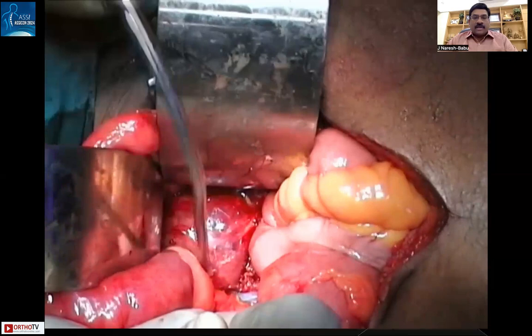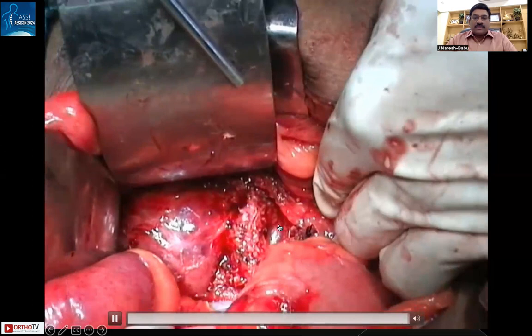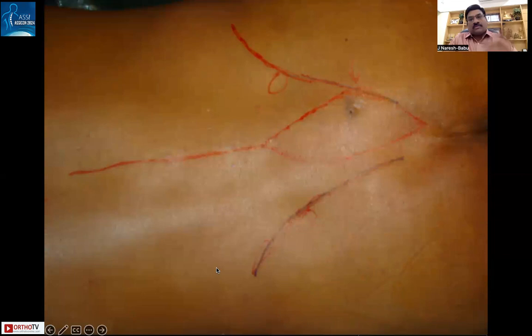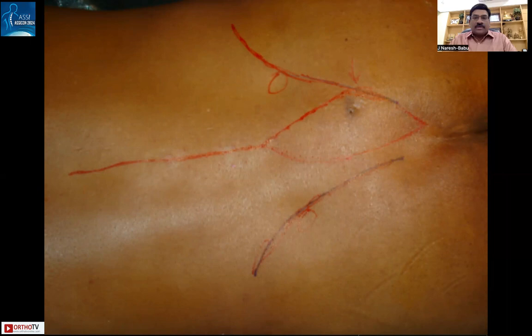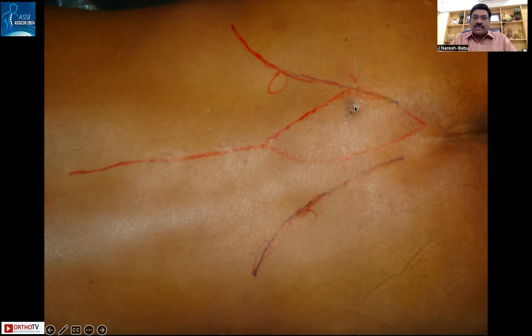Once the anterior procedure is complete and the tumor is fully mobilized anteriorly, it is ready to be removed from the posterior approach. The patient is turned prone. A midline incision is marked, and the tumor along with the biopsy tract skin is included in the planned resection. The incision is designed to remove the entire skin tag attached to the biopsy track.